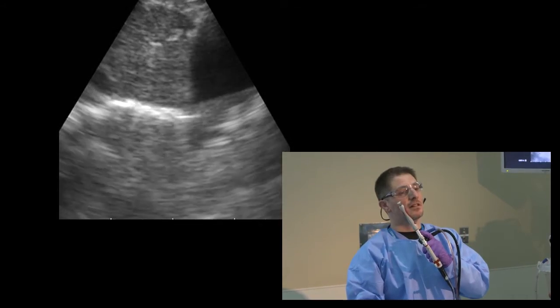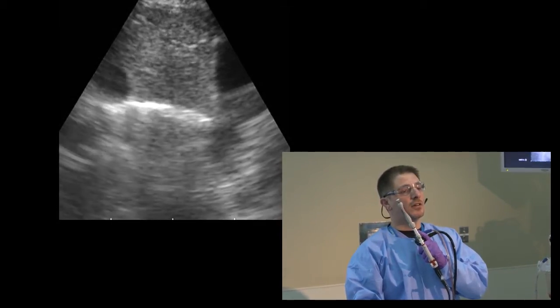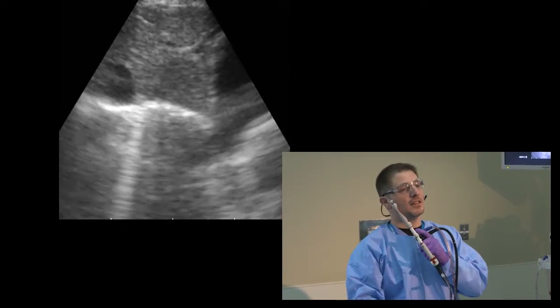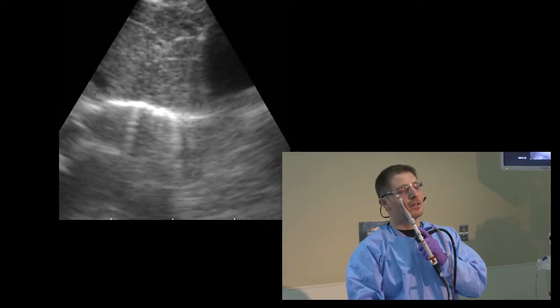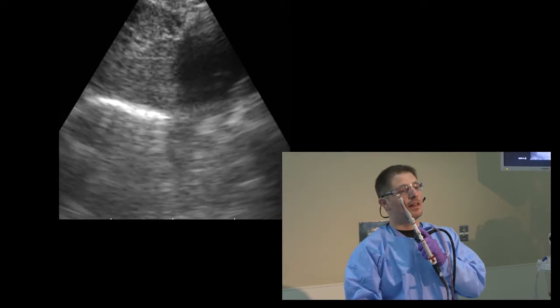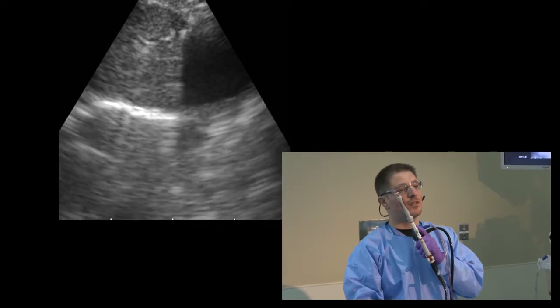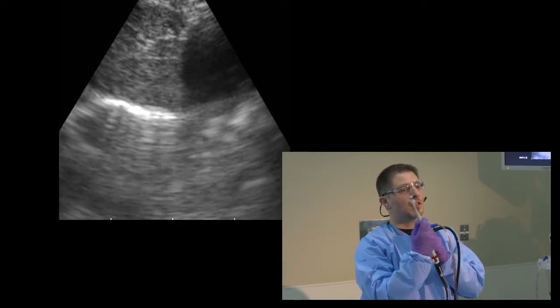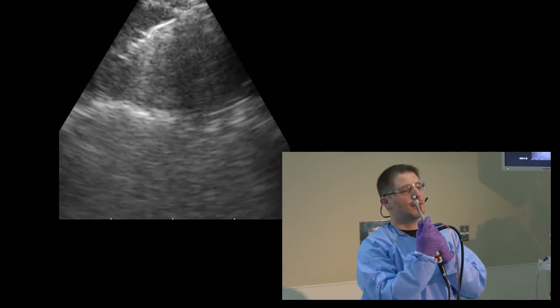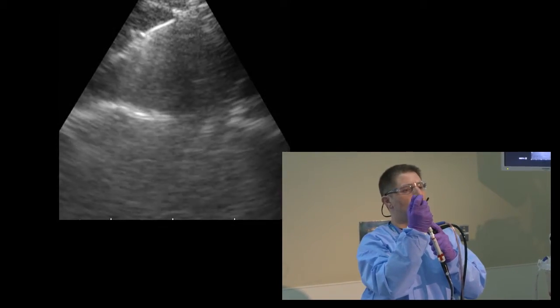As you notice here, the lymph node is in the middle of the screen, but you know your needle is going to go at an angle of 30 degrees from the right side of the endobronchial view. So your goal is to pull the lesion toward the lower part of the endobronchial ultrasound view, toward the left side of the screen, and achieve a direct shot with the needle inside it. You see the shadow of the needle in the center of that lymph node now.